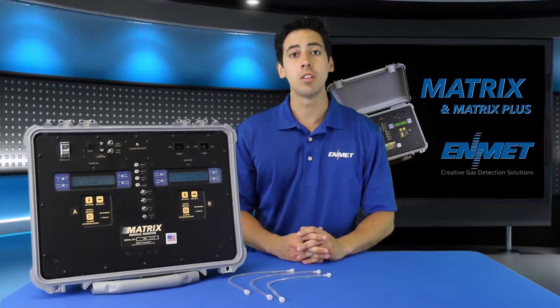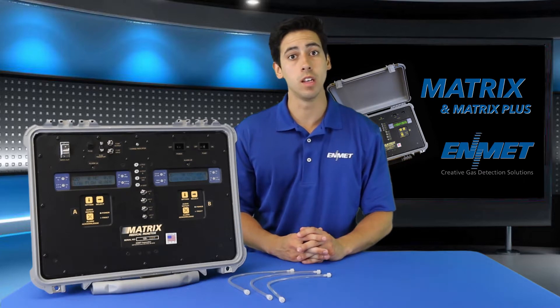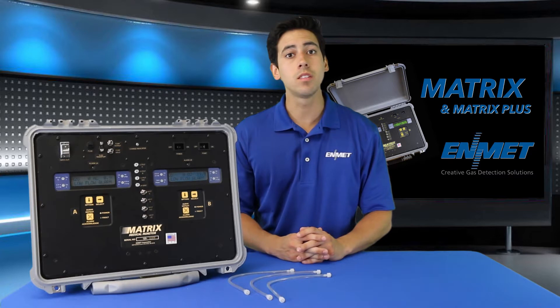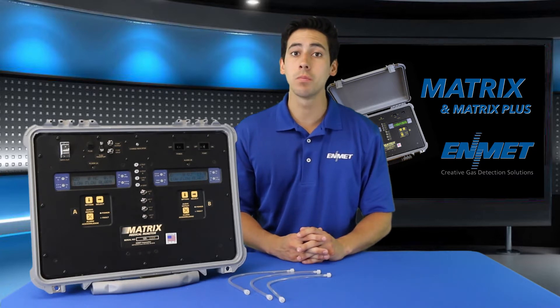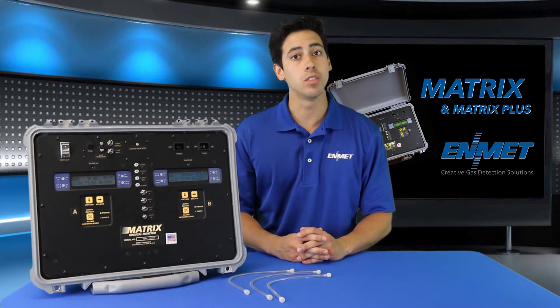Please allow your matrix to warm up in this state for 15 minutes before operating the instrument or performing a calibration. This completes the setup of Edmet's Matrix Medical Gas Verifier. Please contact us with any questions you may have.